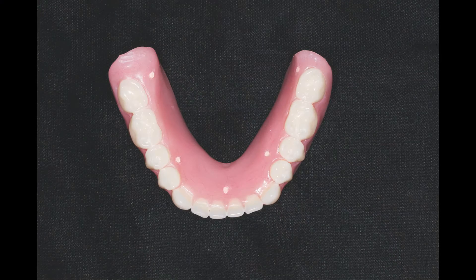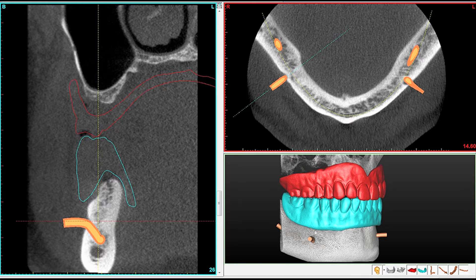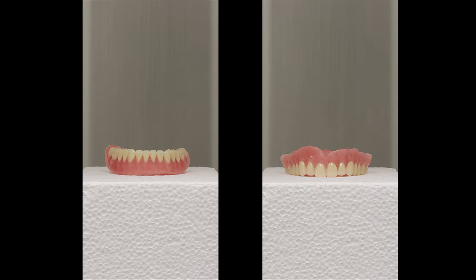The imaging center scanned the patient with the marked denture in place. To ensure maximum accuracy of the surgical guide, it was important to take an accurate scan of the denture following the dual scan protocol, including the intaglio surface and the fiduciary markers. We scanned the lower denture, maxillary denture, and the bite with the NUTOM CBCT scanner.